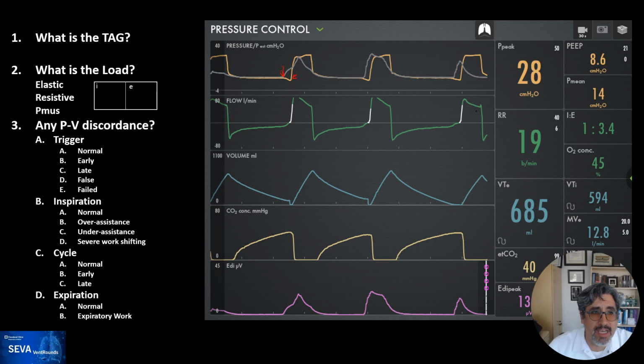And now if you see it, your eyes become evident. Oh yeah, I can see that it was dropping the amount of pressure down, and you can see that the flow was actually approximating the baseline, and it becomes even more evident on the next breath. And the third breath, you can see how it actually reached 0, but it didn't cross over.